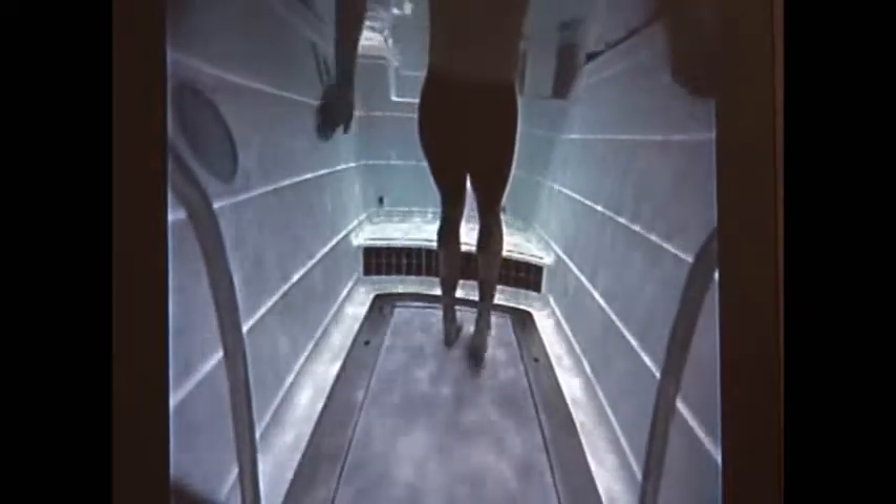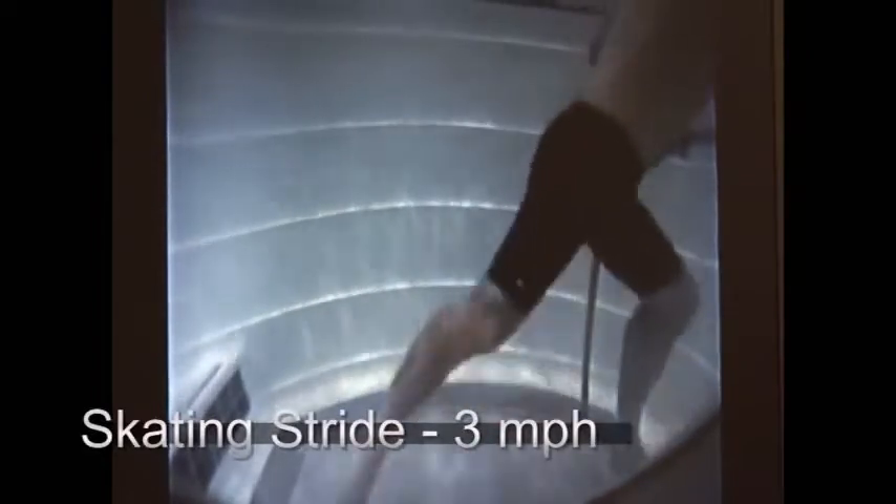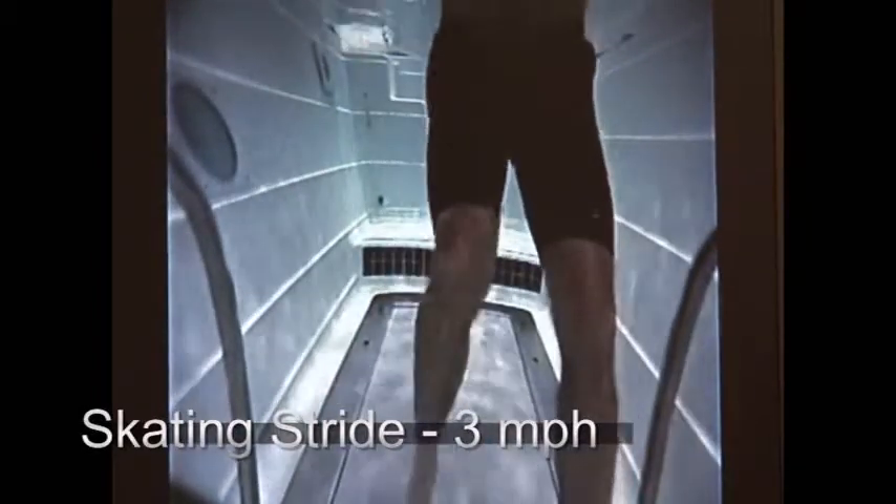Going quite slow here, but it all depends on how far along they are in their rehab. If they're able to handle backpedaling at five miles an hour and opening up the hip, you just progress the rehab depending on how the athlete is doing — pain-free range of motion. I don't have the jets on. Now we're going to go up a little bit faster for the skating stride — it's going three miles an hour now. Just allow the treadmill to take the foot back, and then it's more important, once you get back, to pull it back quicker.